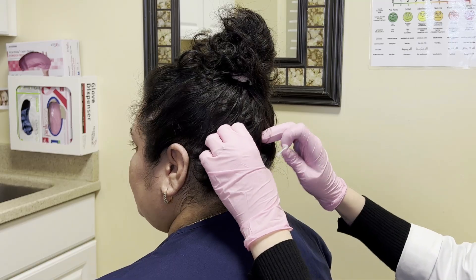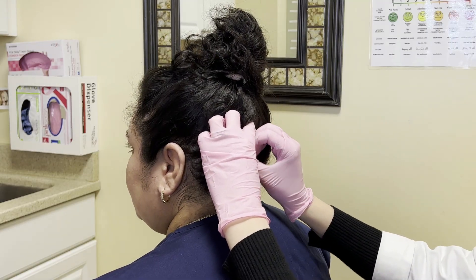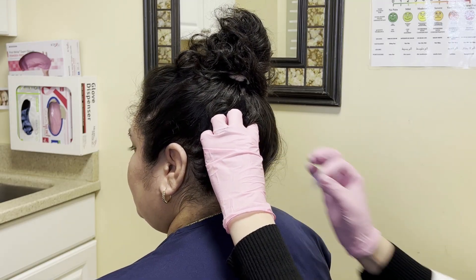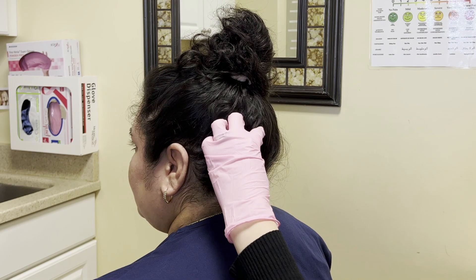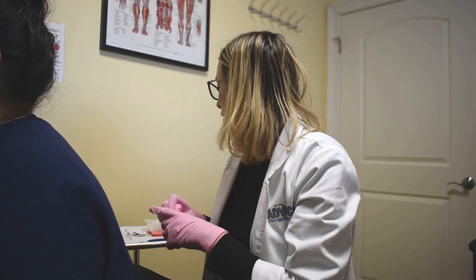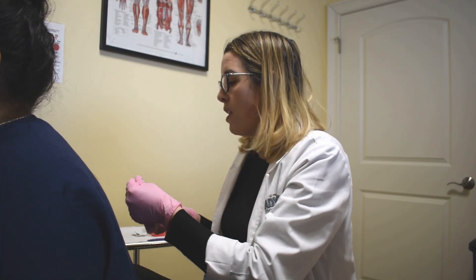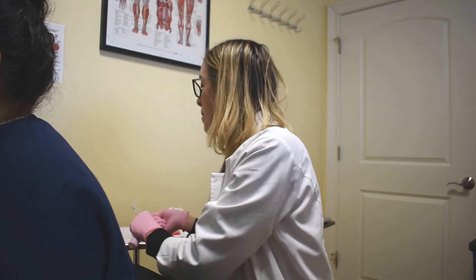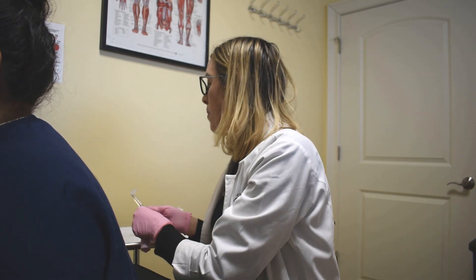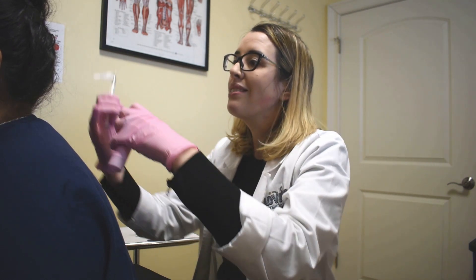So with that area marked, all I do is clean the area and we use something called a vibration anesthetic device here. This is a tool that vibrates to kind of help block the pain pathway, or how the body reports pain back to the brain.